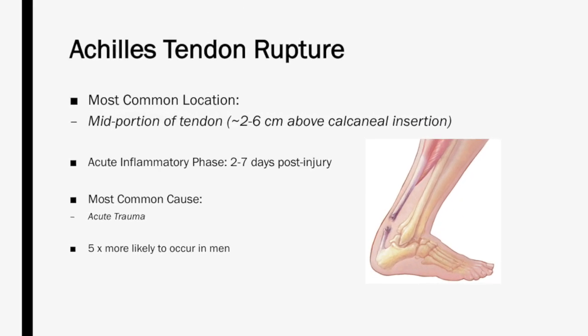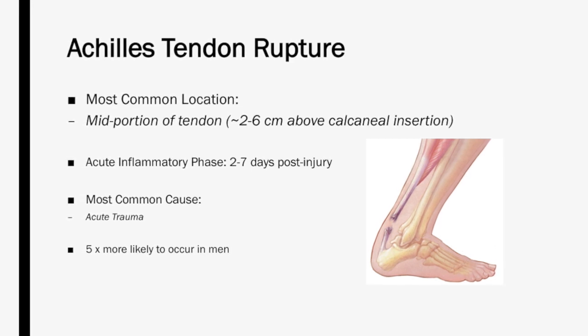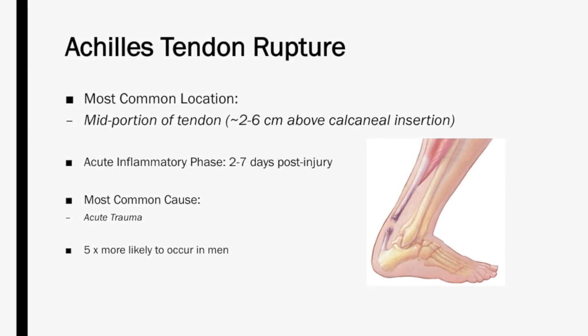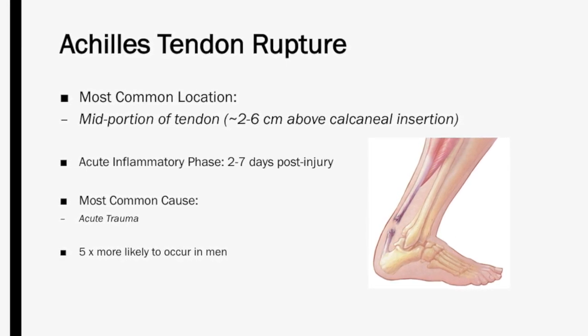Now that you've seen an Achilles tendon rupture and know what iontophoresis is from our lovely intro, let me tell you about treating the Achilles tendon with it. First, I'll share some interesting facts about Achilles tendon ruptures. They are obviously very painful.